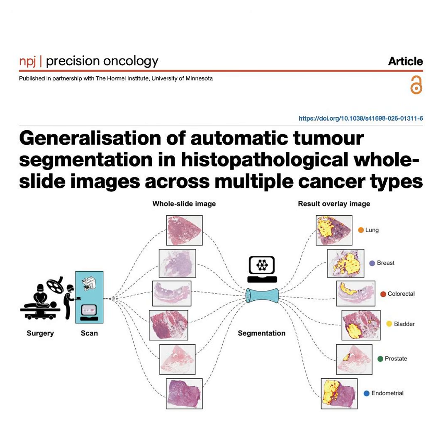Right. Then it hands that dense data off to the decoder, the DeepLab V3 Plus. And if the encoder is finding features, the decoder's job is to rebuild those features back into a spatial map, right? Exactly. DeepLab is famous for semantic segmentation. Which means understanding not just what an object is, but exactly where its borders are. Yes. DeepLab V3 Plus is excellent at this because it can analyze the contextual information at multiple scales simultaneously.